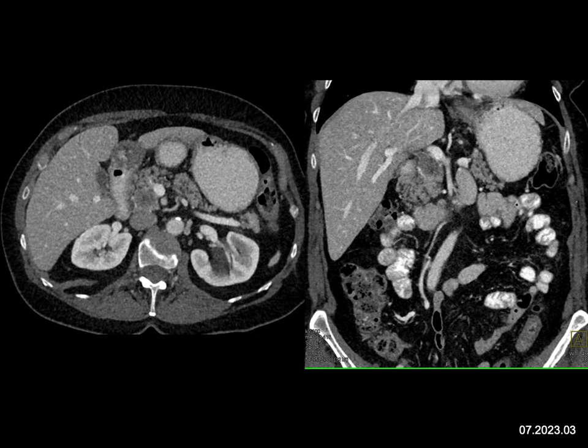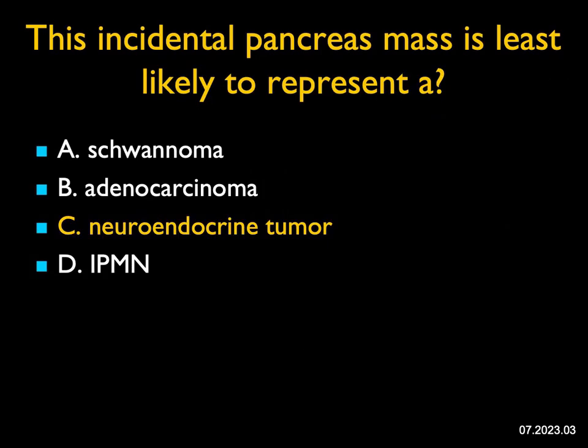That's a rare but real possibility. The least likely is going to be a neuroendocrine tumor. Although neuroendocrine tumors can be small and obstruct the pancreatic duct, and occasionally they're hypovascular and commonly they calcify, they rarely are hypodense — they're usually hypervascular. So if I had to say what's the least likely, I'm going with a neuroendocrine tumor.